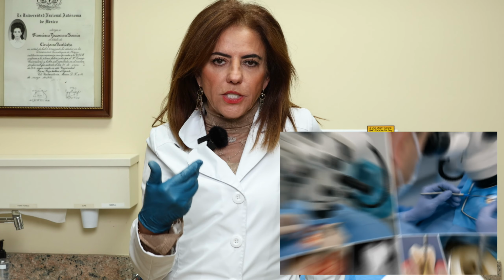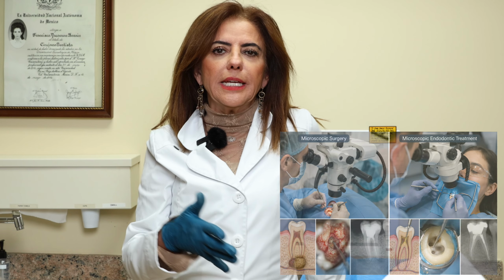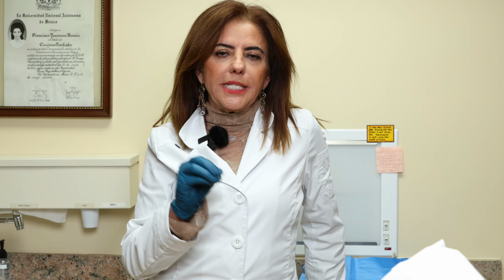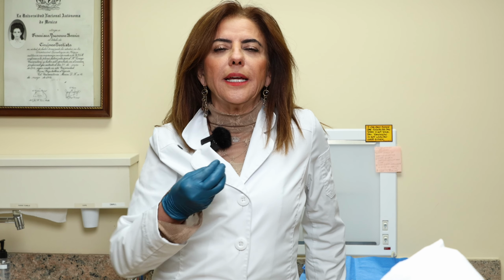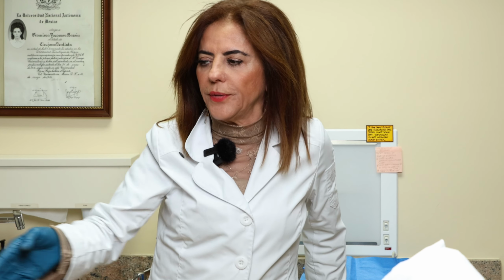But in today's technology, I do microscopic endodontics, so microsurgery. For many of the steps that we do now, the companies have developed instruments that are so small because we can see them on the microscope that we have at the office.